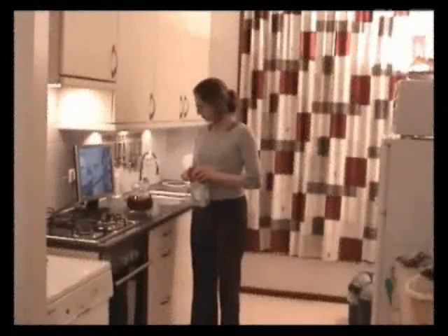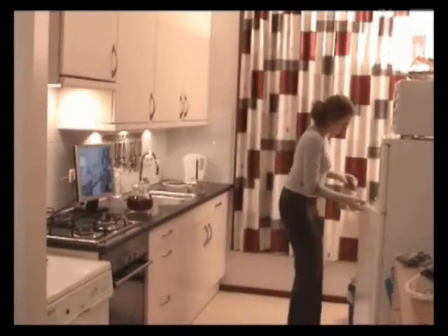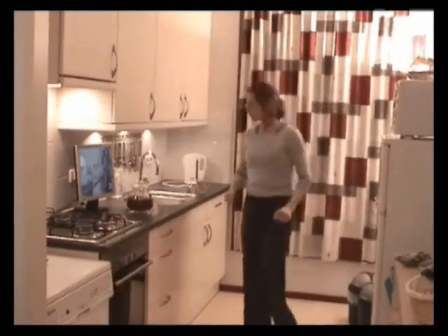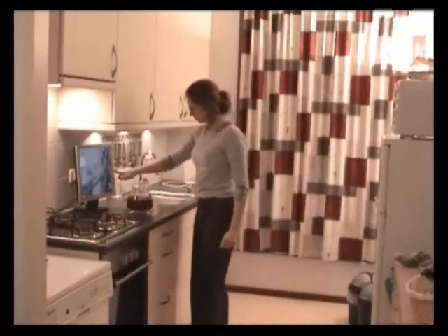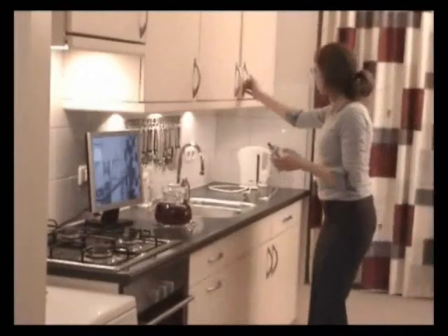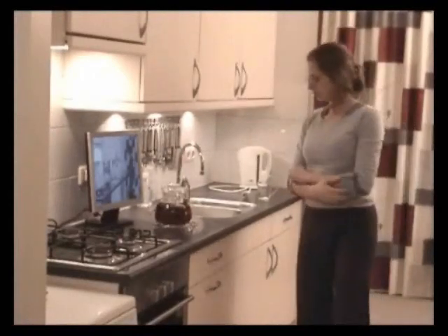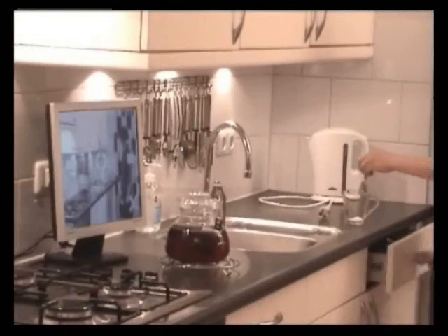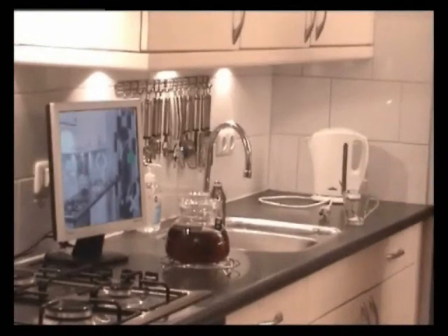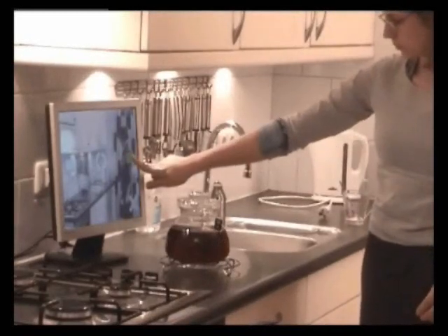The Activity Assistance module is context-aware in that the module continuously observes the person's interactions with the kitchen environment. In this example, the system senses actions such as the opening of drawers and cupboards, as well as the usage of kitchen appliances. While offering activity assistance, the system uses this sensor information to provide feedback to the person with dementia. In particular, a person is cued to proceed to the next step once the system detects that the current step has been completed successfully.